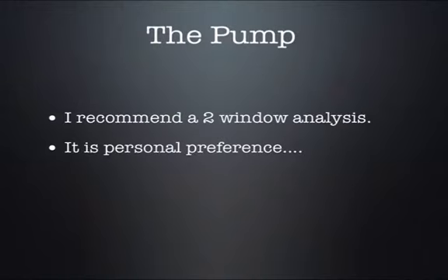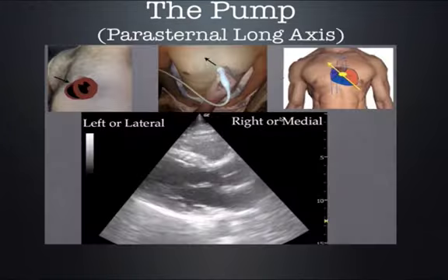Now, with evaluating the pump, there's multiple windows to accomplish this. I recommend a two-window analysis. Which windows you use is ultimately your personal preference. I'll just tell you now how I play it. Usually I start off with the parasternal long axis view.